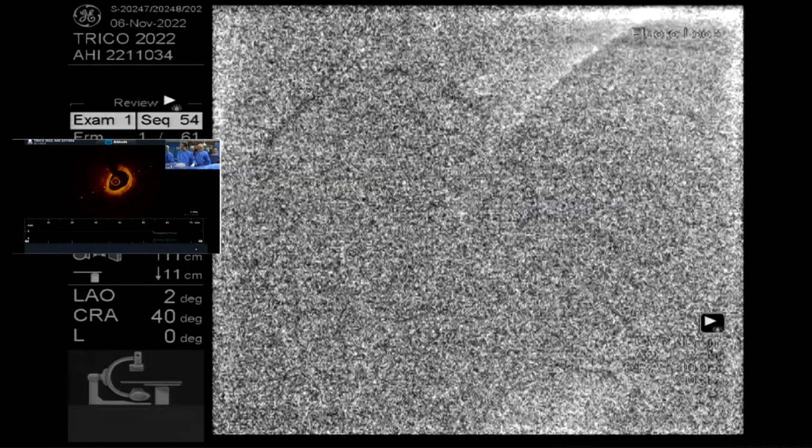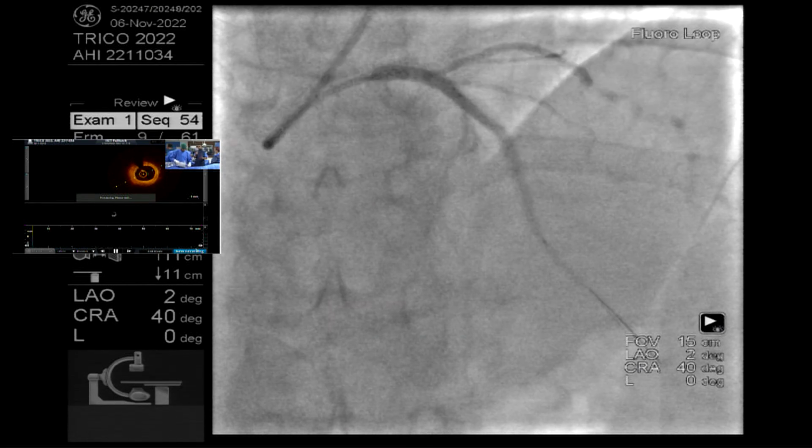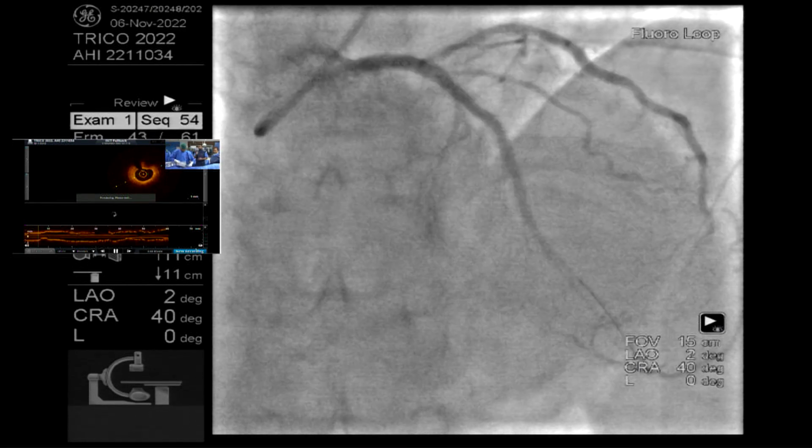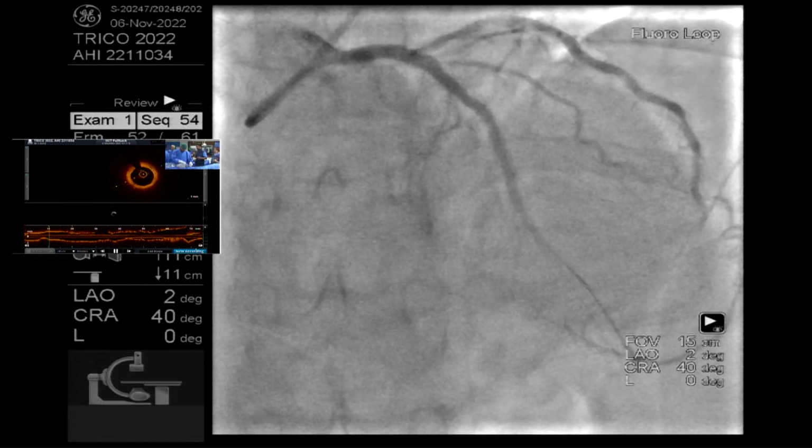And the other discussion is that 62% of plaque in the left main involves both branch vessels. It's the minority of plaque that only involves one. So the argument becomes, is it safe to leave the other one, assuming there's no plaque?